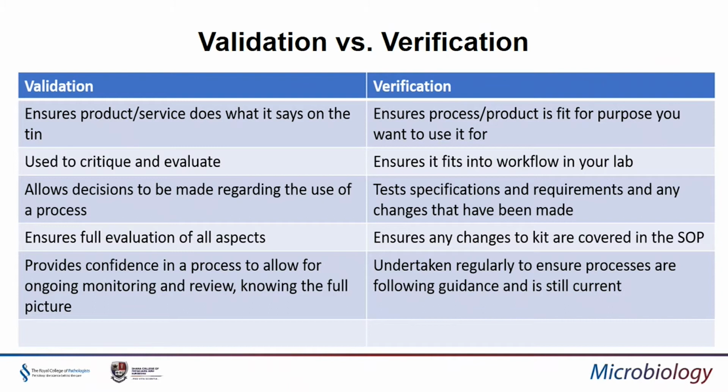So it tests specifications and requirements and any changes that have been made. And verification is ongoing. So you normally do an annual verification, particularly for any steps of uncertainty of measurement or anything like that. And it also allows you to ensure any changes to the kit are covered in the SOP. So maybe if a new target is included in a test now, you need to also verify the new target when you re-verify. So it's like a constant ongoing process. And again, it's undertaken regularly to ensure the processes are followed, the guidance is followed, and is still current as well.